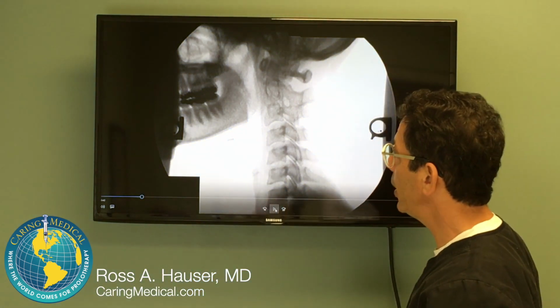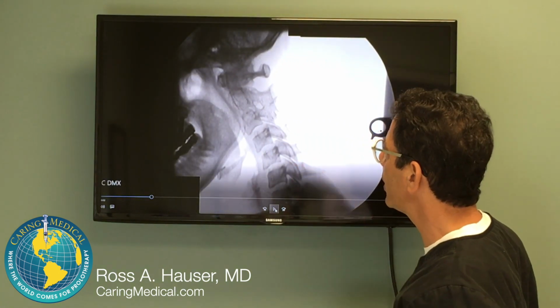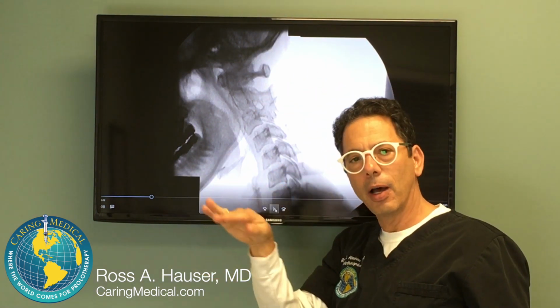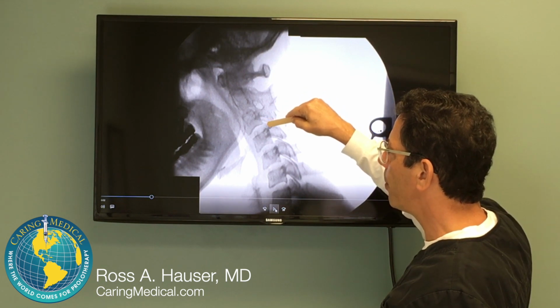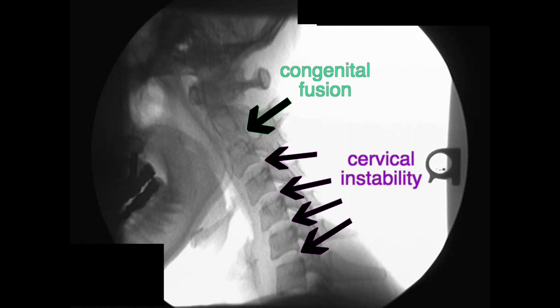We're going to watch Brittany's digital motion x-ray, and what we're looking for is whether there is anterior slippage of one vertebra on another. That slippage is the amount of instability. So if we could run the video. What you'll see with her video is these two vertebrae are fused, and below it we're going to see a lot of instability, so we'll stop it. In other words, you could see where these two vertebrae are fused, they're in alignment, and look at below the fusion, it's almost like a person walking downstairs. See the posterior part of C3 here, then you have to go this way, posterior, to get to the posterior part of C4, then walk down here, walk down here, walk down here. So she basically has instability at all the levels below her fusion.